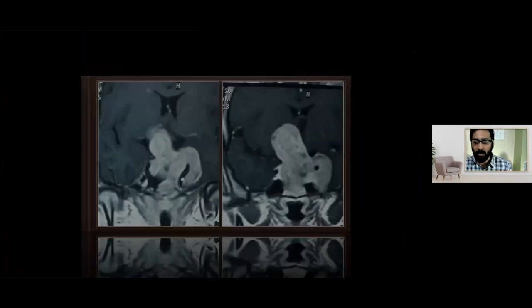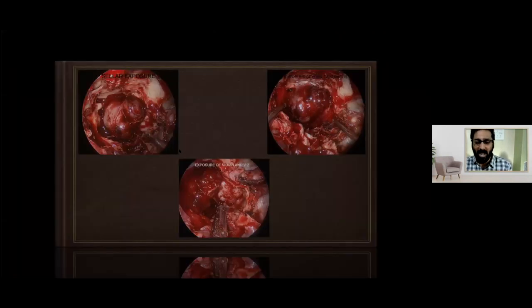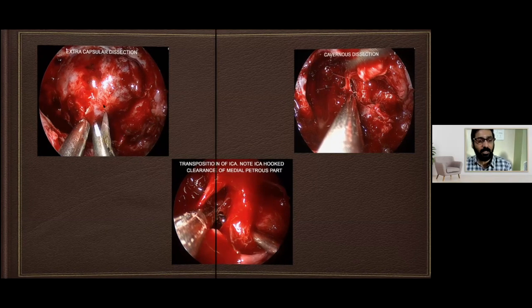And of course, a pituitary like this, if you want to remove, then you have to give a good exposure. So proximal bone exposure, try to expose the bone very nicely, and then you can actually manipulate the carotid. You see the carotid is being hooked here and moved and transposed. And of course, you can get beautiful views of the cavernous triangles.